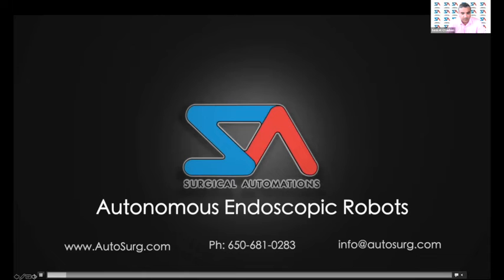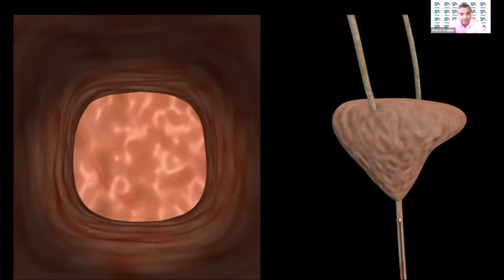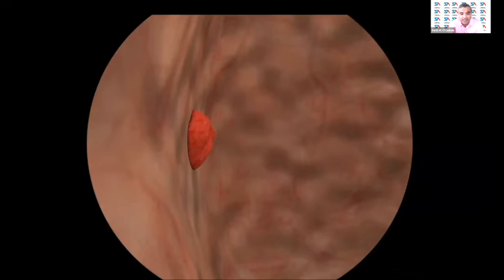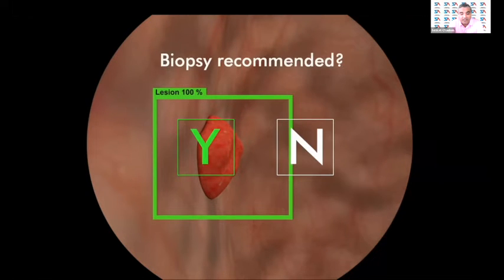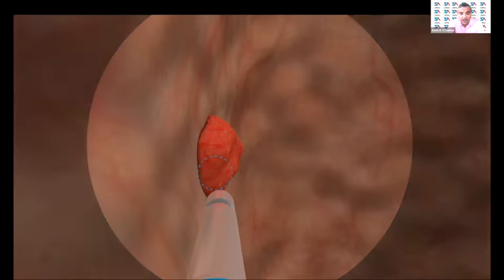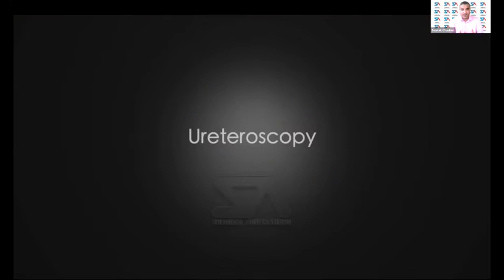The other indications can be in form of, for cystoscopy and bronchoscopy, again, you know, the robot is attached to the stand. It advances using the user interface. The wireless tablet inside the urinary bladder, it starts scanning, looks for normal anatomical landmarks. In this case, it finds a lesion. Again, the robot recommends to take a biopsy. Biopsy forceps is attached next to the robot. It advances. It will give a trajectory of where it's going to take a bite. Once the physician okays it, it's going to go and take that bite. Again, the user interface in all these, it's a wireless tablet.